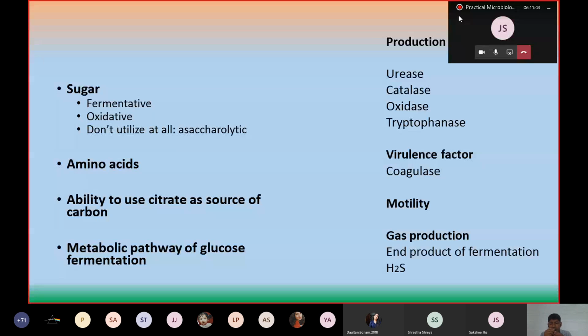For all these biochemical properties we can design a test to check for. Those different tests we have already listed earlier, we'll see again. So all these features of the bacteria can be detected, and this will lead to definitive identification of a particular bacteria.